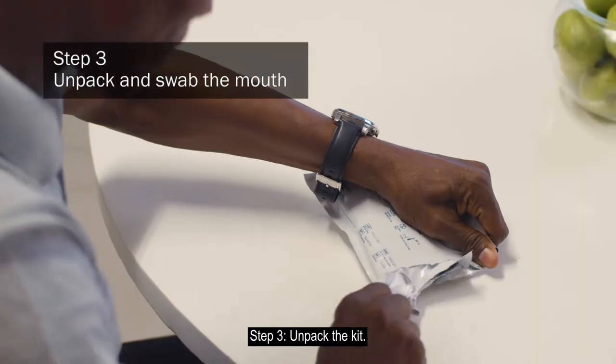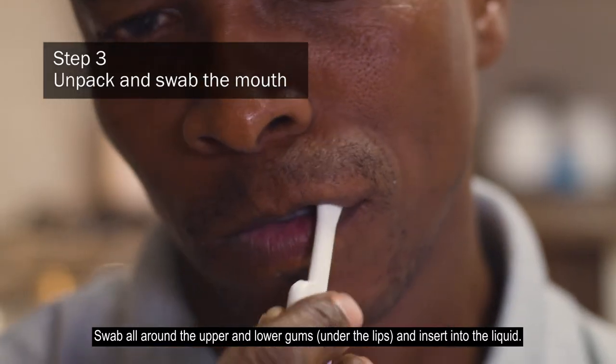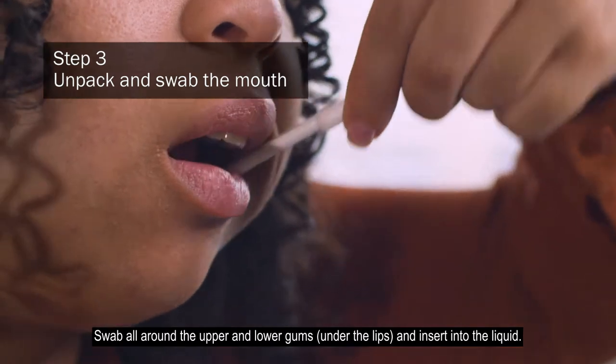Step 3: Unpack the kit. Swab all around the upper and lower gums under the lips, and insert into the liquid.